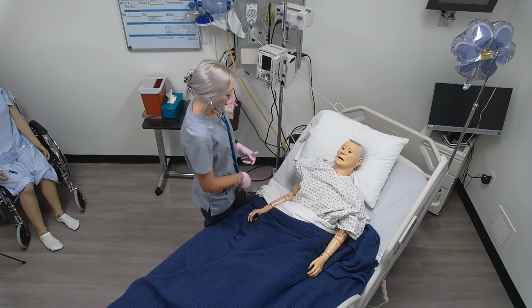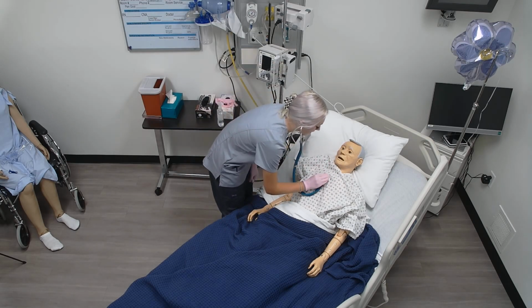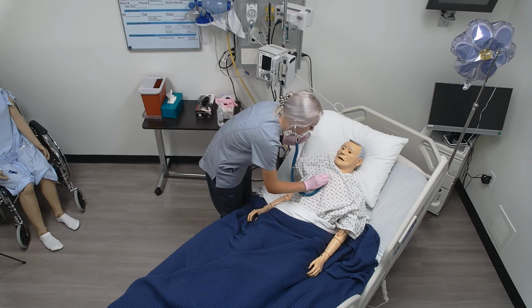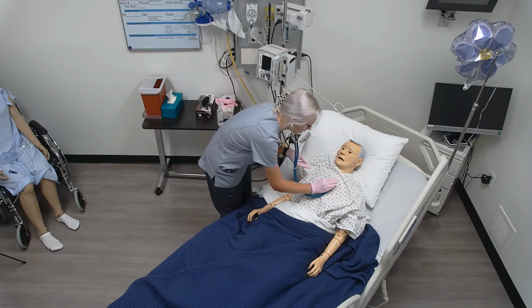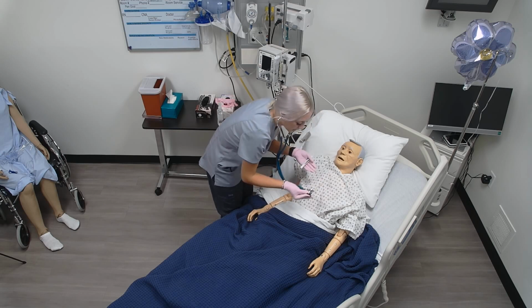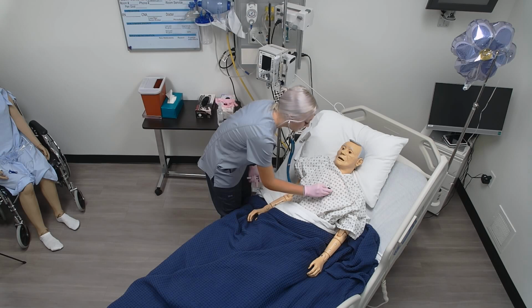I'm just going to take a listen in 5 spots. I'm listening in the aortic region for any abnormalities and just to make sure that the heart rate I recorded earlier corresponds with the normal sounds now. Okay, now I'm listening to the pulmonic region. Now I'm going to listen to Erb's point. Great, and I'm making sure that I'm listening a few seconds in each place just to make sure I don't miss anything.